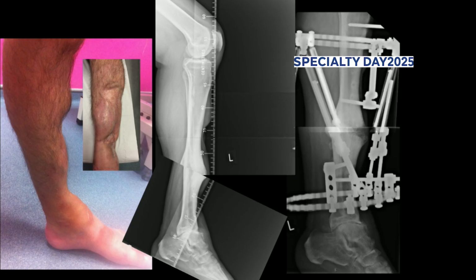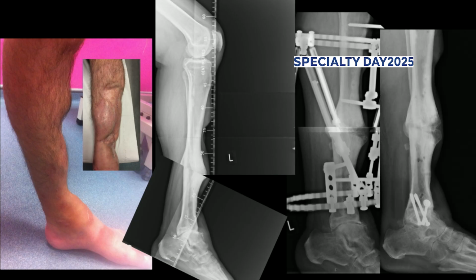So that's my straight tibia. And you can see I unmasked the equinus deformity. I came back later because it was painful and did ankle fusion.